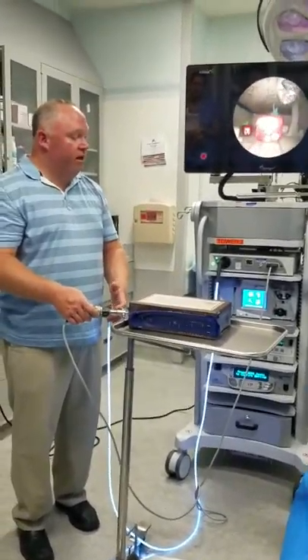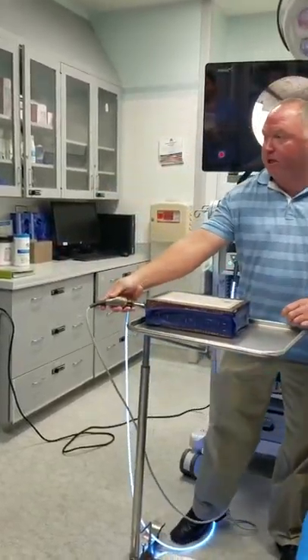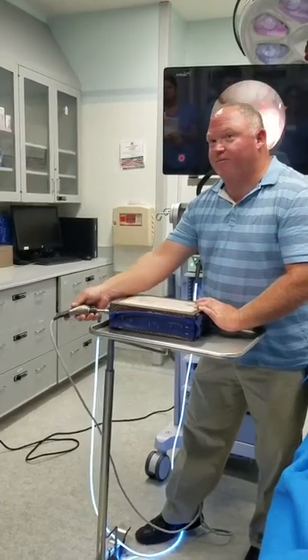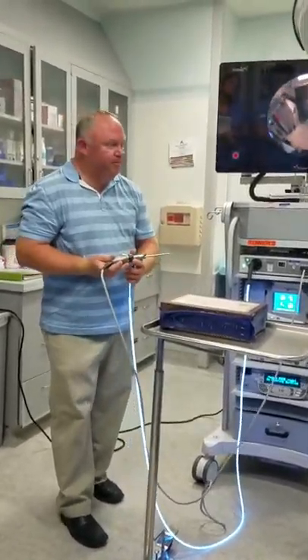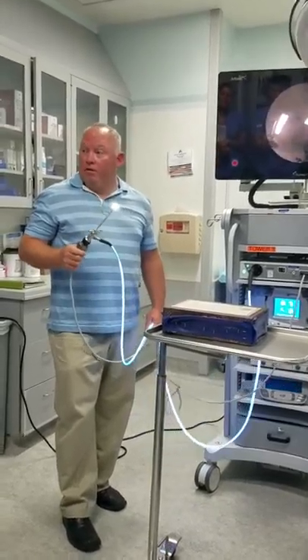Just learning that. And then again, when I'm doing it, usually I'm like this. If they have it where they want it, I'm going to be upside down, looking this way, when I'm doing the scope. It's opposite, right? So it makes a little difference. Not a big deal. Everything should be very slow. It's the main thing you remember. Okay? You want to go first, second, third? Doesn't matter. Done, ready?